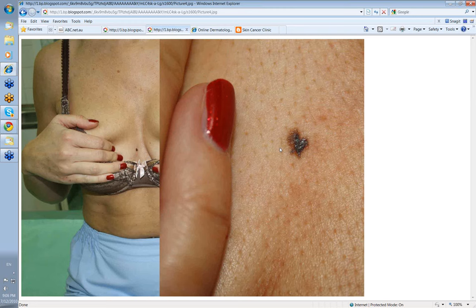Cliff, what do you think of this particular lesion? Well, it's an irregular lesion both in shape and in pigment density, and it's pigmented. It's in an area where you would expect it to be noticed.